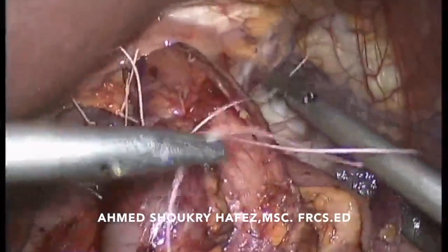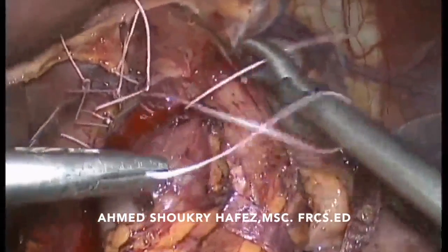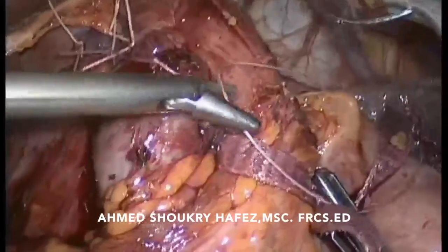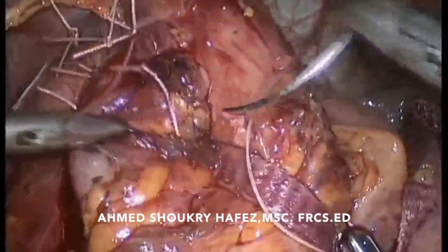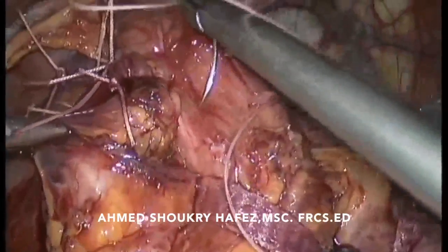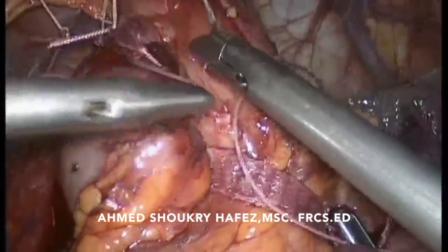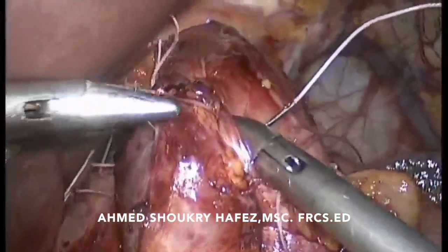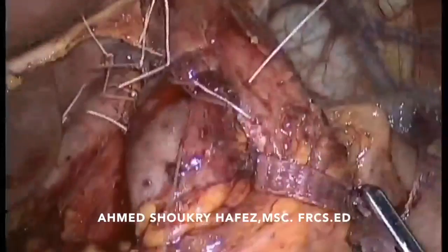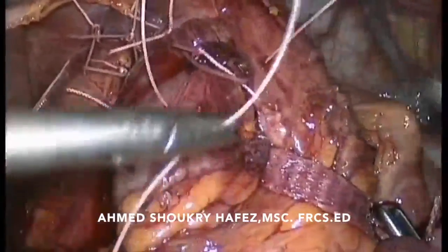The third and very important difference is that the wrap in the Toupet must be at least double the length of the wrap of the Nissen fundoplication. In the Nissen fundoplication, we aim to do a short floppy Nissen, but in the Toupet, the wrap must be at least 4 cm long compared to the 2 cm wrap of the Nissen fundoplication.